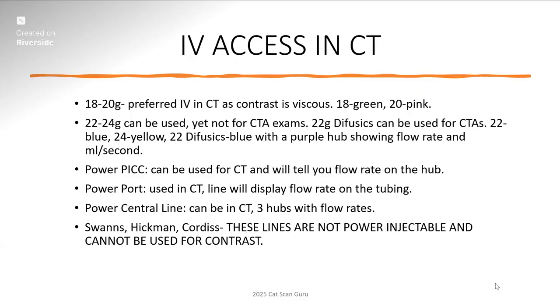Now, 24 gauges, we use those for pediatrics, okay? They can be used under special circumstances. It really depends, but usually 24 gauges are reserved for pediatric patients. And usually for pediatric patients under the age of 5, you can get away with doing a hand injection, okay?